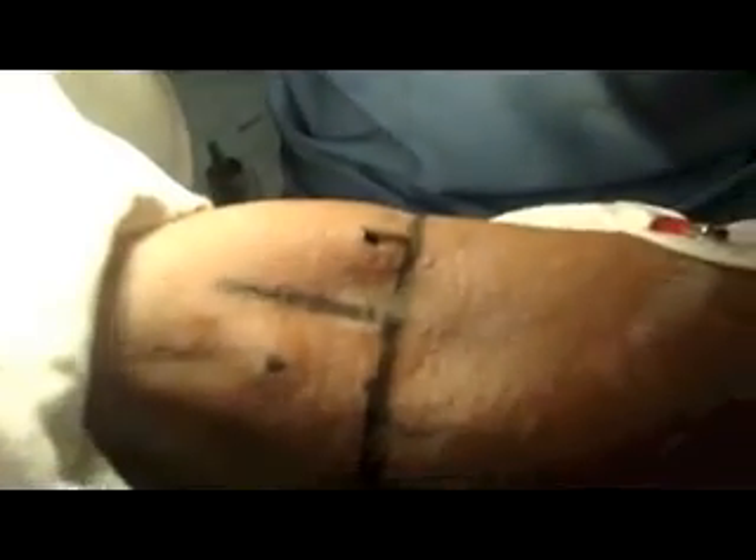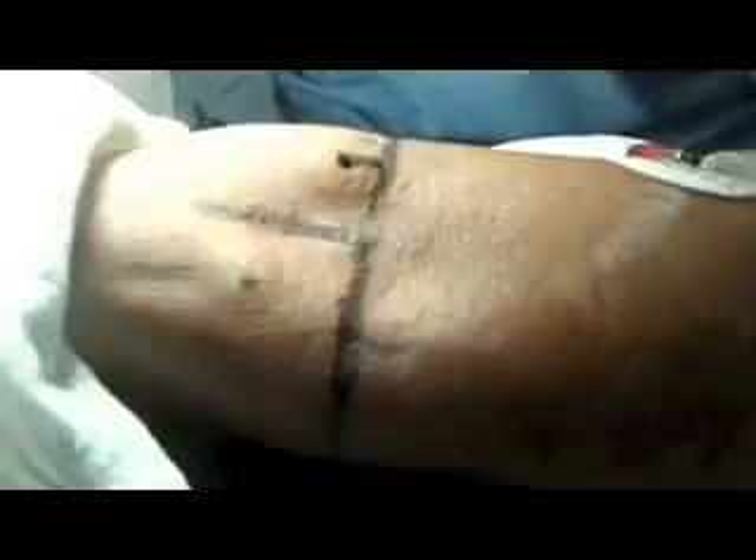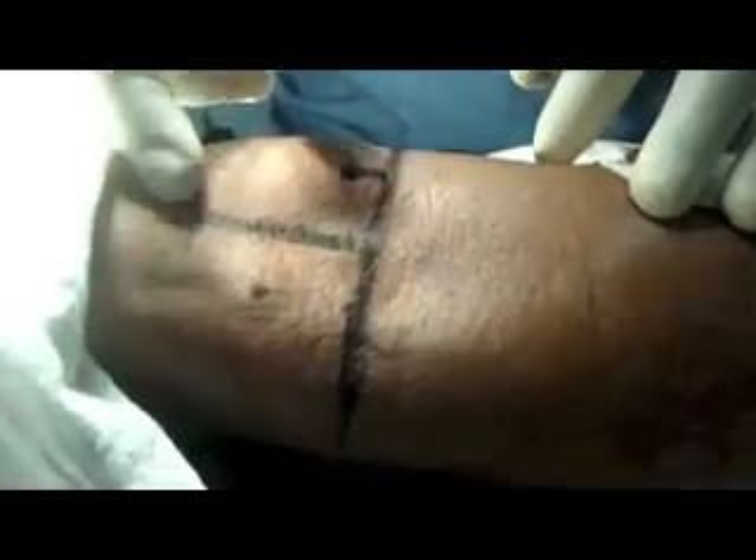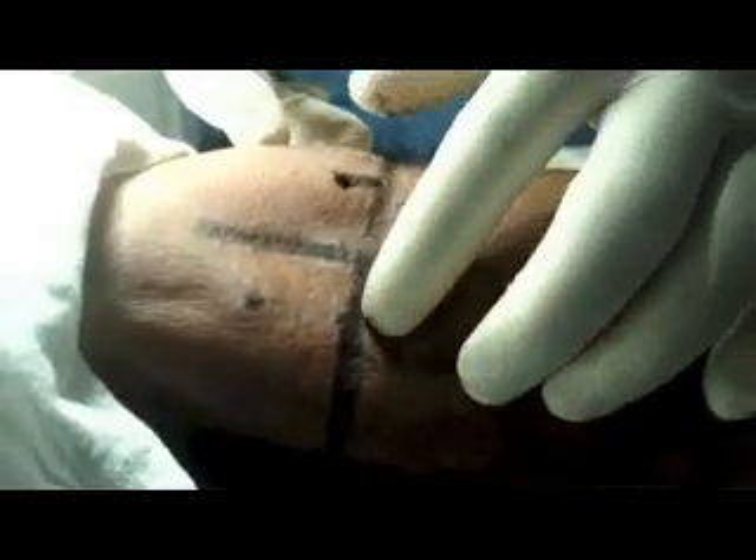This is a case of distal radius fracture coming for closed reduction and manipulation. We'll go for median nerve block and radial nerve block. The landmarks are: this is the elbow crease, this is the bicep tendon, and 2.5 cm lateral and 2.5 cm above is the point for radial nerve stimulation.